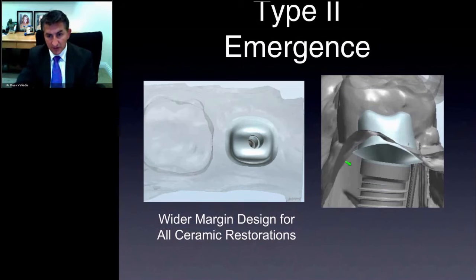Now look at this design. You may say that's too obtuse. That angle may be 55 or 60 degrees coming outward. So is that the right emergence for this case? Each case is a little bit different.